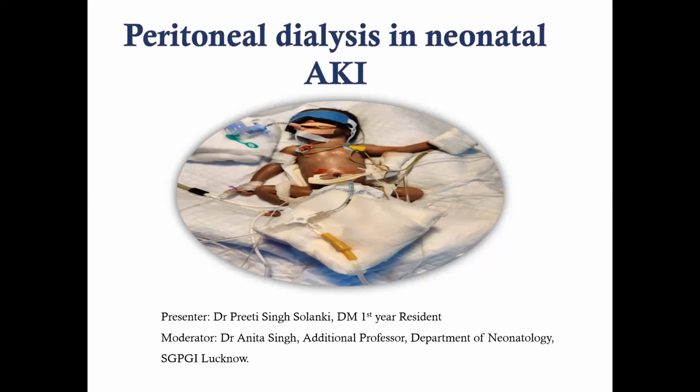Wait, Preethi. Somebody is asking, if the platelet count is less, what do we have to do? So, Preethi, would you like to answer this question? Yes, ma'am. If platelet count is less, but there is no bleeding, we can continue peritoneal dialysis. And if platelet count is less than 20,000, we can give platelets and then start peritoneal dialysis. 20,000 must be the lower limit.